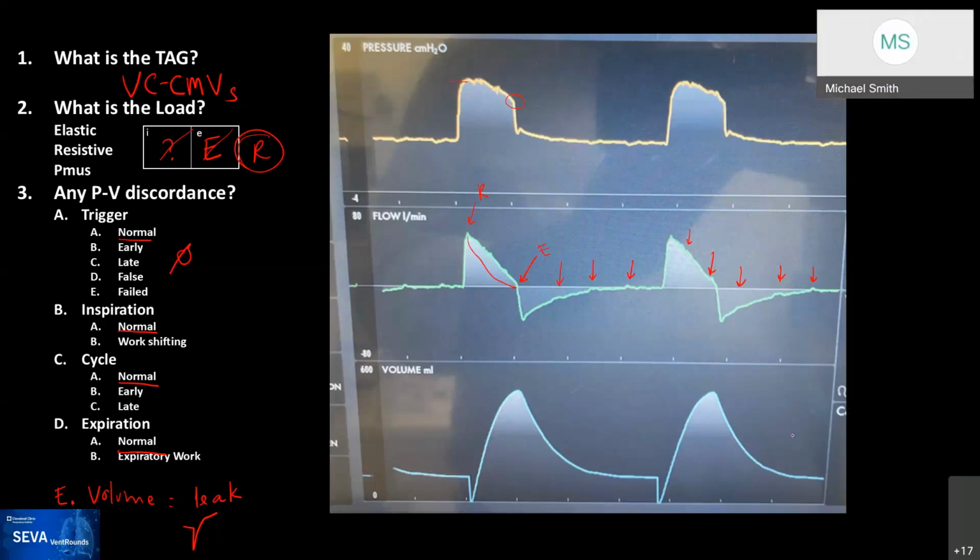Yeah. So that's one. Now you're starting to see how you put this case together: COPD, so he has a high resistance, and he has a bronchopleural fistula. How do I deal with this with the ventilator? How do I adjust the settings to deal with the leak from a bronchopleural fistula? And you can imagine that if the patient had a bronchopleural fistula and increased resistance, you probably want to reduce the auto PEEP on this patient, right? Yeah, as much as we could.